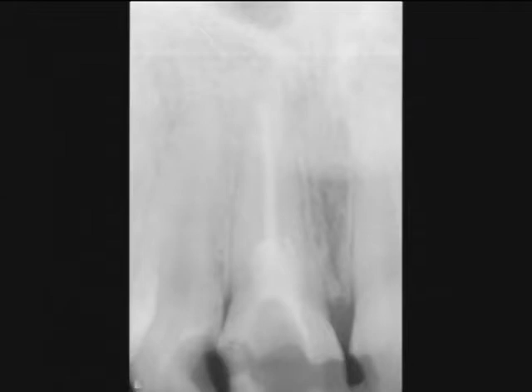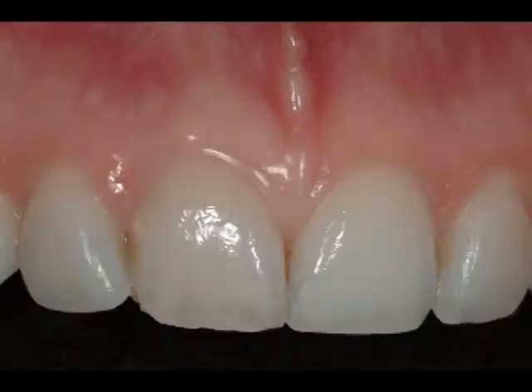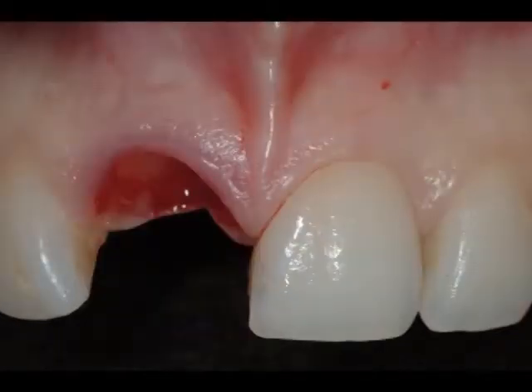Following our guidelines for the atraumatic extraction technique, we will use our Petrangero elevators and forceps to remove the tooth atraumatically, preserving soft tissue contours, causing no damage to the soft tissue, so that we can preserve our contours and have our temporary sculpt that tissue through the initial healing phase. And at this point, we see that we have preserved all of our soft tissue architecture.